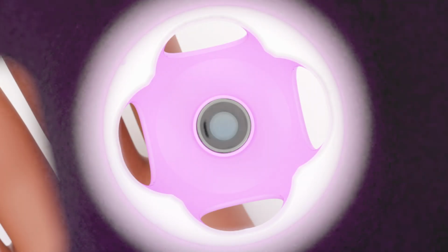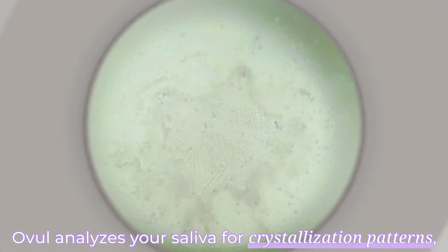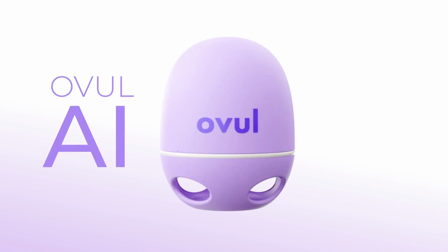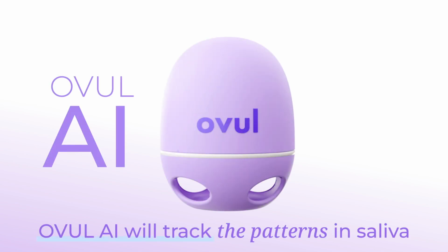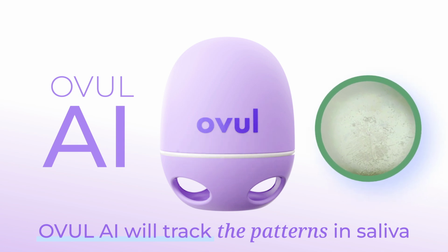Ovul analyzes your saliva for crystallization patterns, which change with your menstrual cycle. Ovul AI will help you to interpret the results. You will see AI suggestions on the results page in the app. Ovul will track the patterns in your saliva.